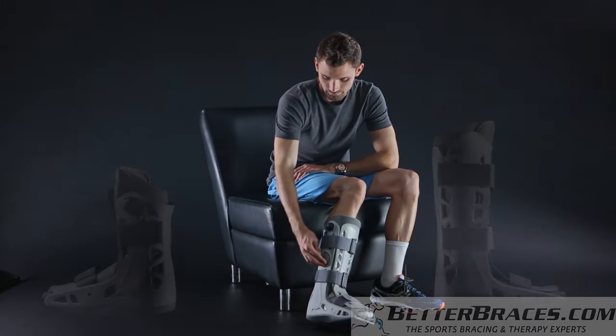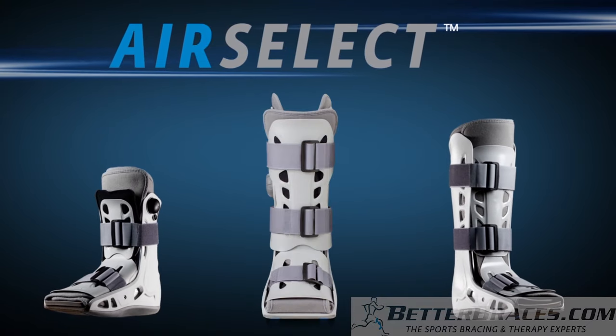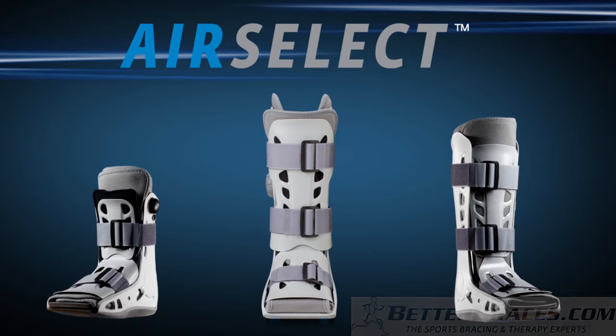The AirCast AirSelect Standard. The ultimate combination. Designed for comfort. Engineered for healing.